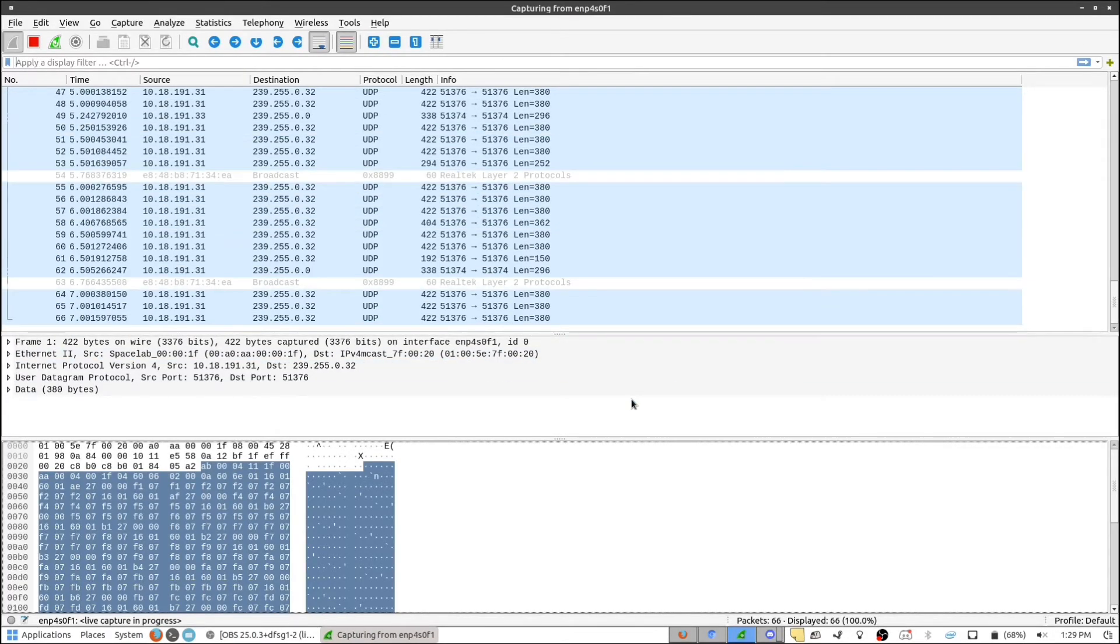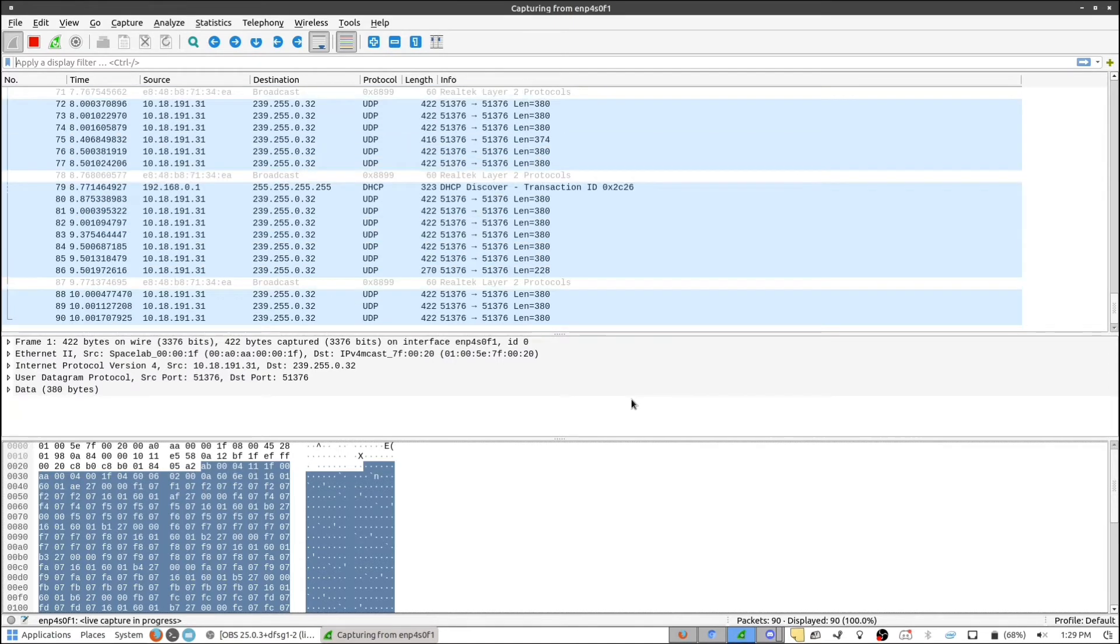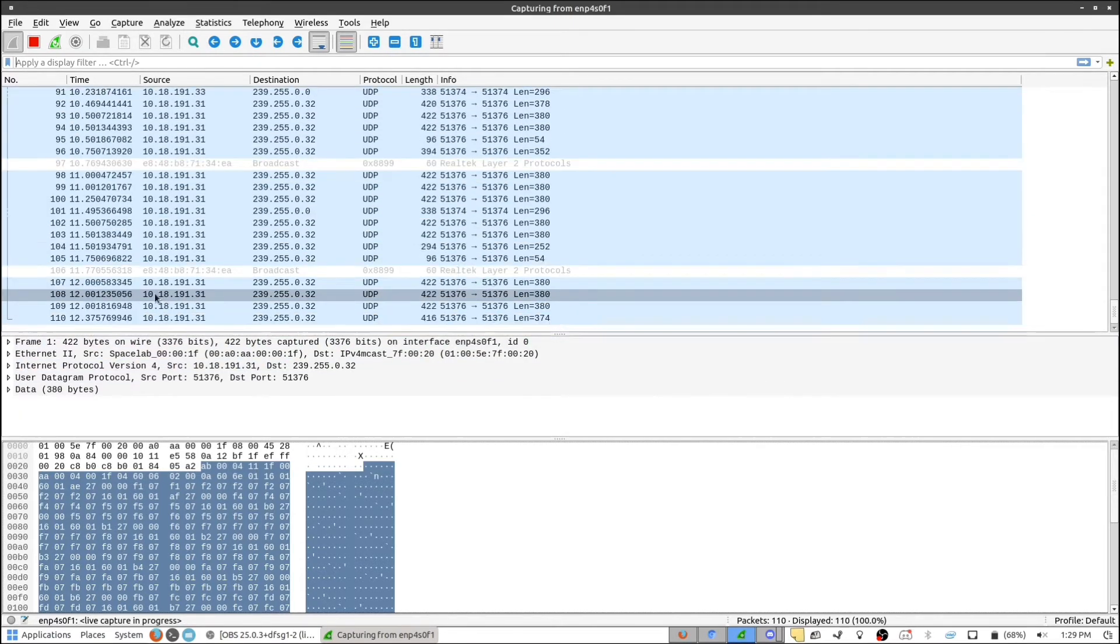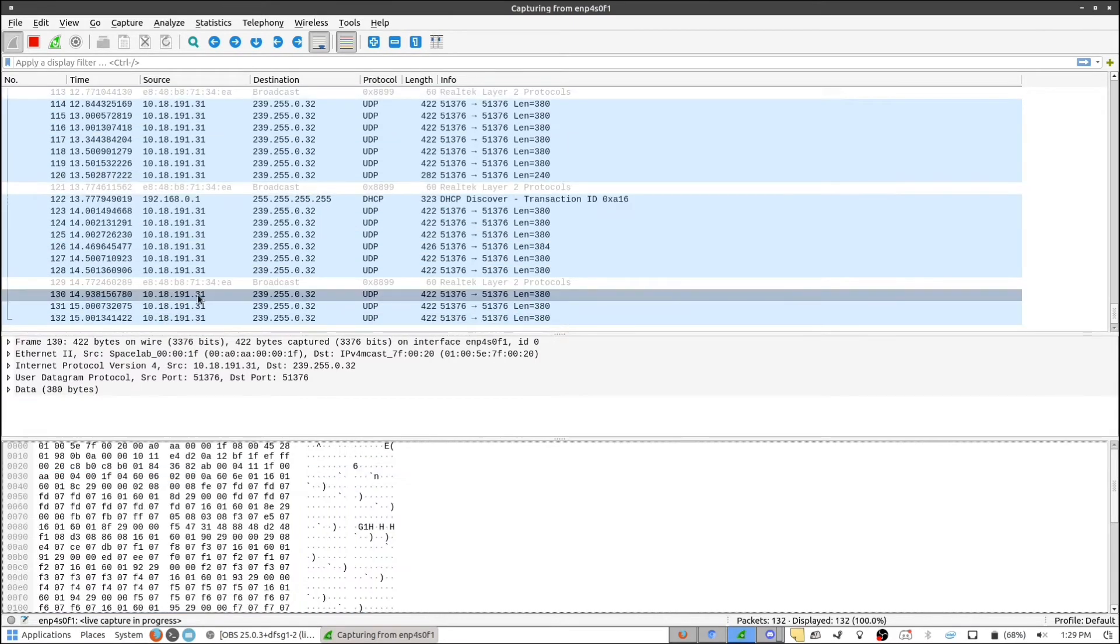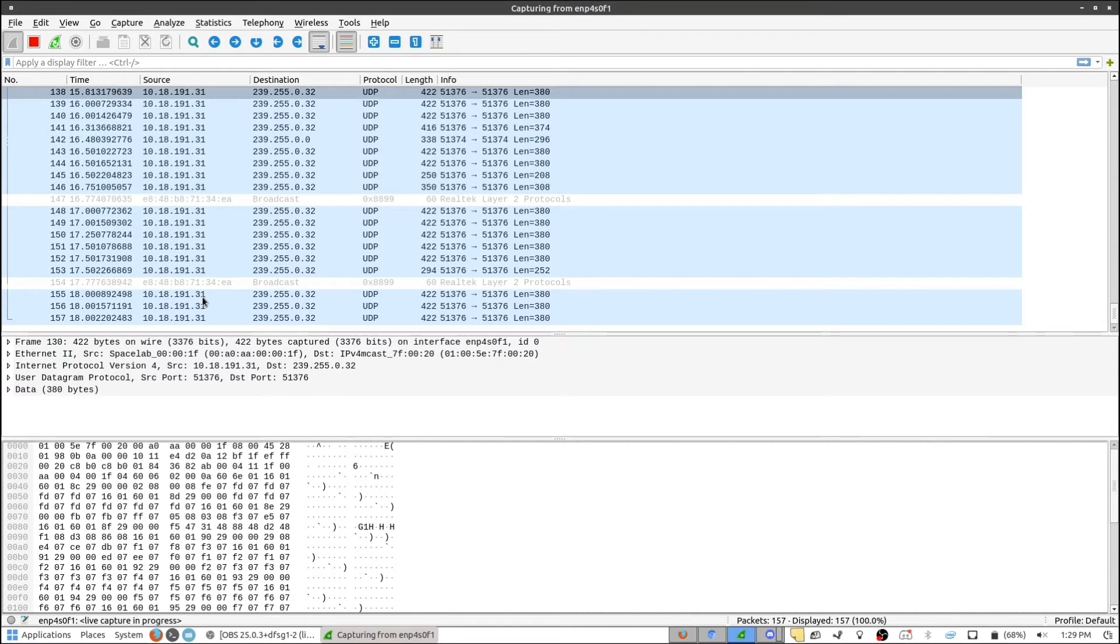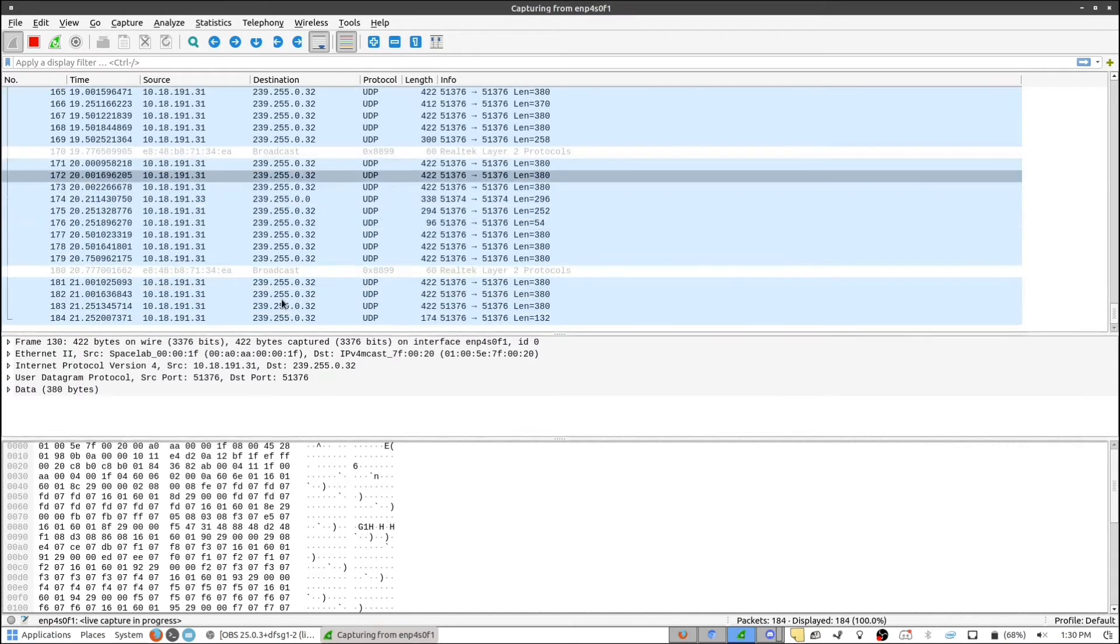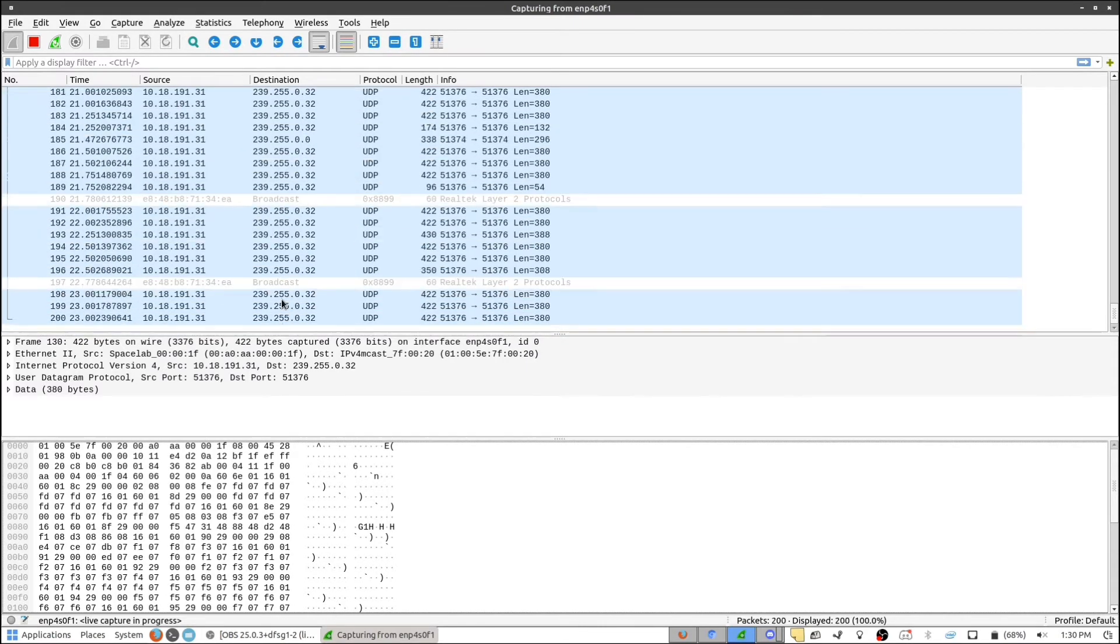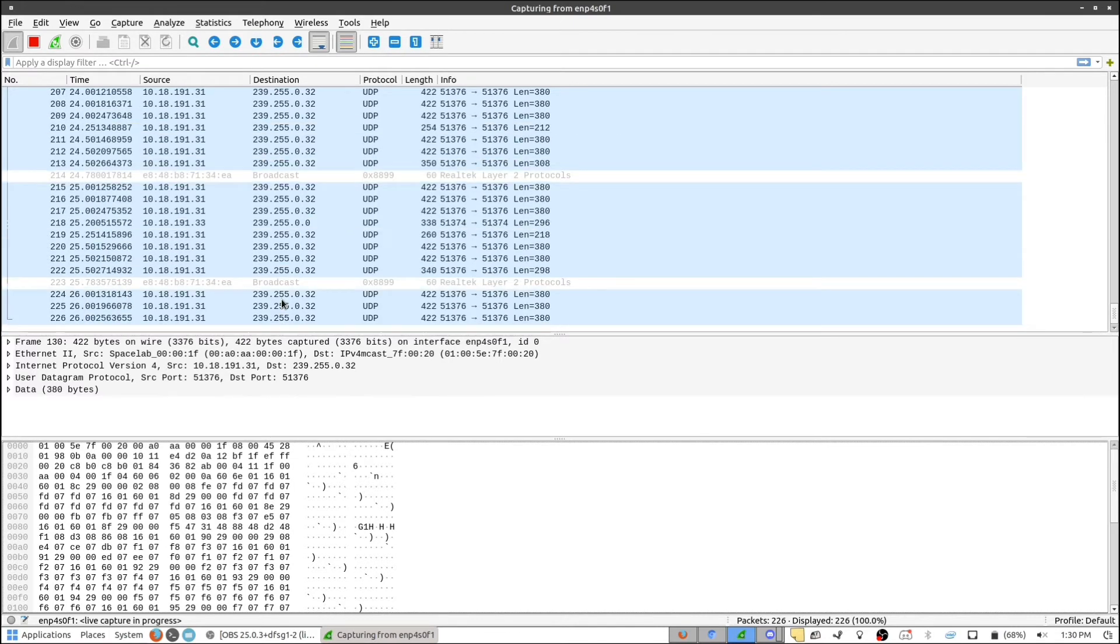So you can see the traffic here. And it's all being generated pretty much by let's call it ECG 31, which is the last number of the ECG's IP address. And this is a packet that's being sent out as far as it can. The ECG is essentially trying to find other ECGs to talk to.